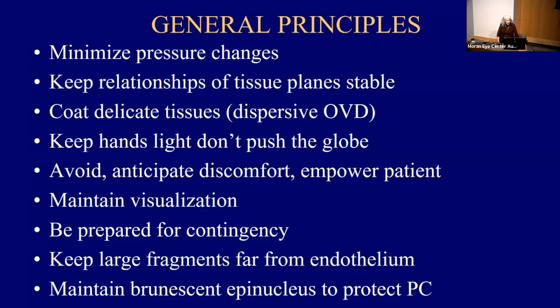You want to keep large fragments far from the endothelium, and this is particularly true of the brunescent lens. And for the brunescent lens, I developed a technique where I leave the nucleified, dense, leathery epinucleus in place till the very end to protect the posterior capsule and keep the zonules expanded.